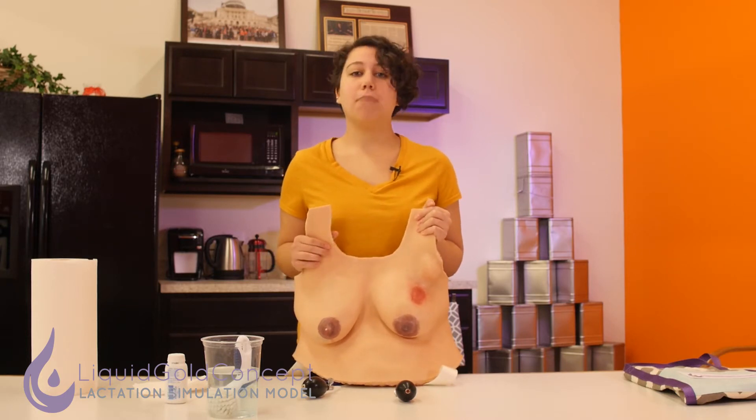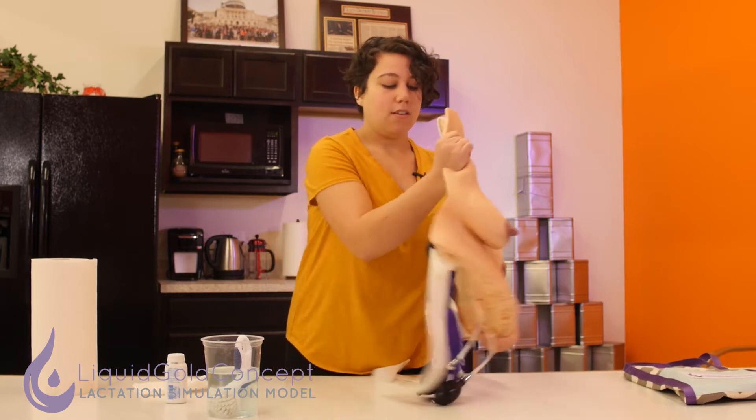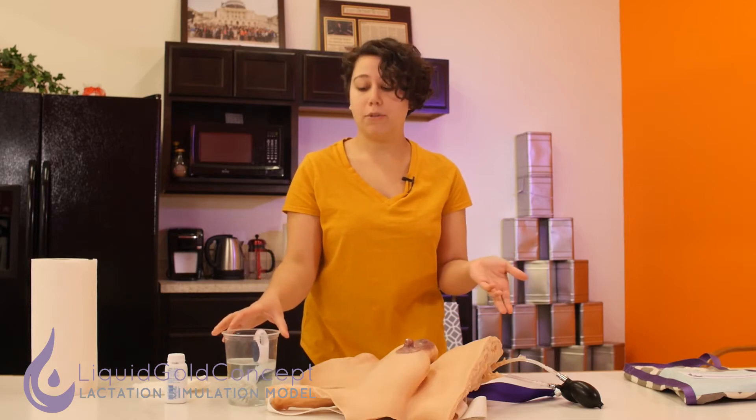Hi, I'm Sam from Liquid Gold Concept and today I'm going to be showing you how to care for your lactation simulation model, or LSM. There are a few ways you can go about doing this. You can put your LSM in a sink and wash her with warm soapy water, or alternatively you can make a cup of warm soapy water and lay her on a table and wash her that way as well, which is what I'll demonstrate today.